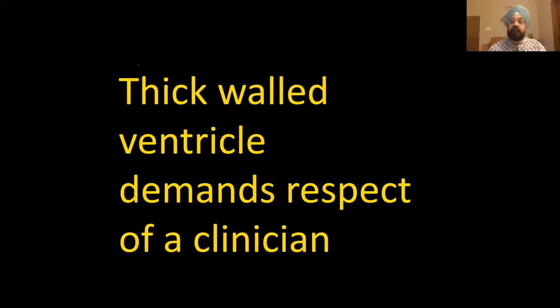We could use occasionally the old technology as well. Yeah. Good. Sir, I think I agree with Dr. Adi and would you that we should not call it left ventricle hypertrophy, we should call it left ventricle thickened, because it's actually not hypertrophy. There are so many other causes for that. Is that correct, sir? Yeah, that's true.